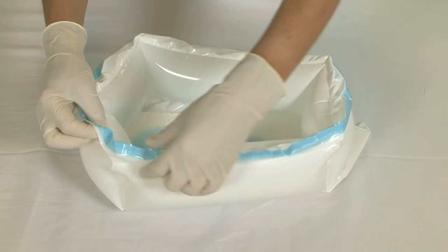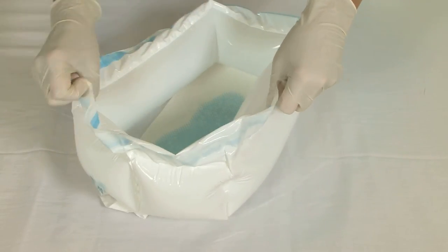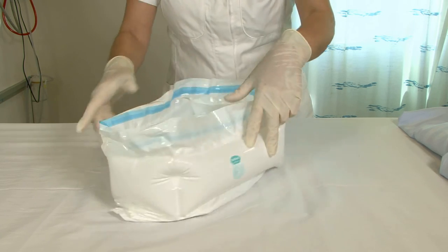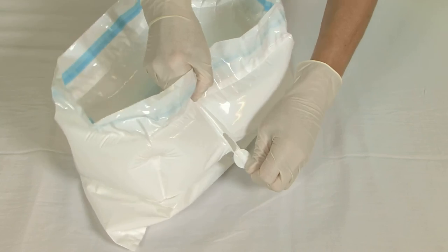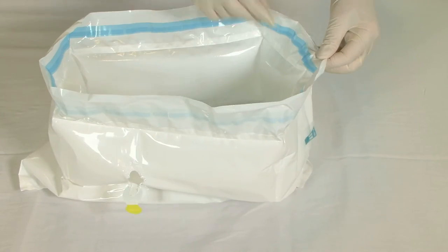After use, roll up the edge. Locate the release tab on the side of the bedpan. Pull the tab firmly, tearing the outer layer of plastic to release the air.